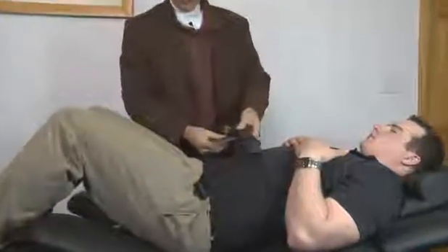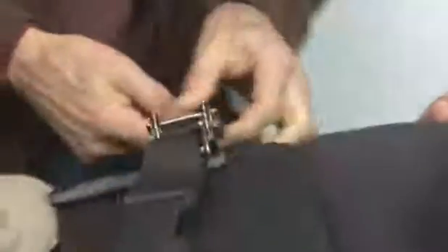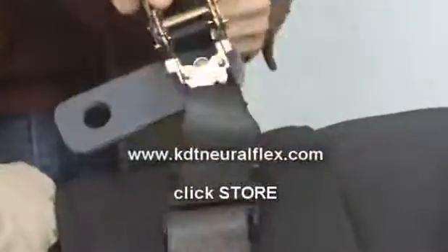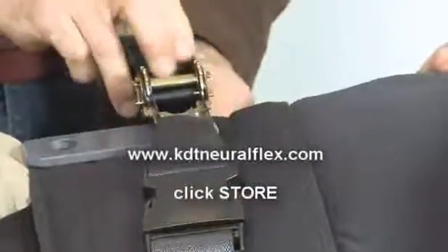The ratchet utilizes a simple slide-through that allows you to shorten the length of the ratchet prior to application. We attach the buckle and then shorten the length sufficiently to get the position exactly where we want it.